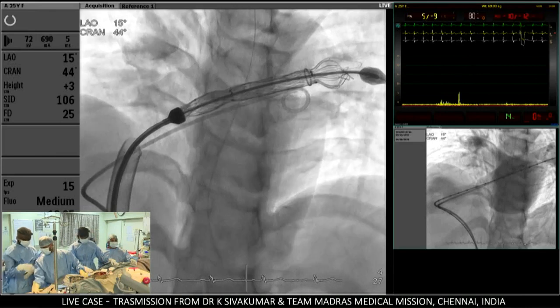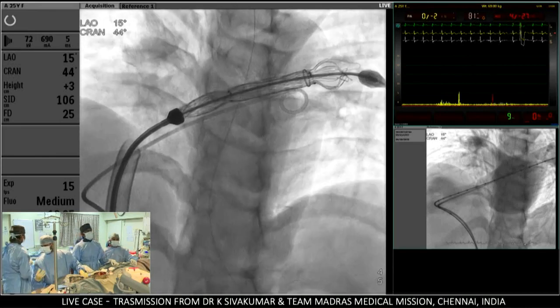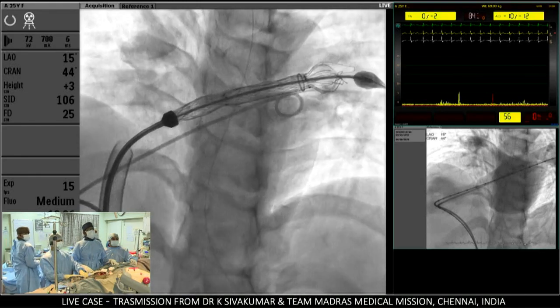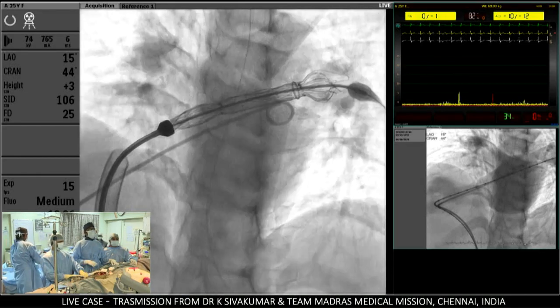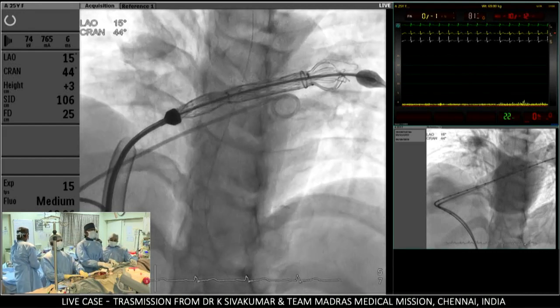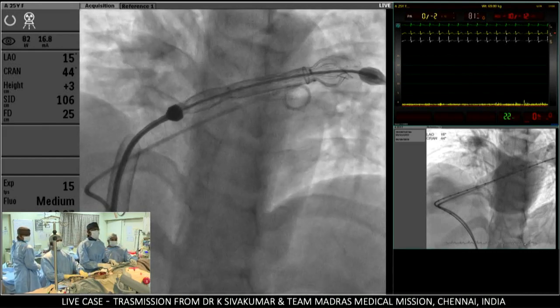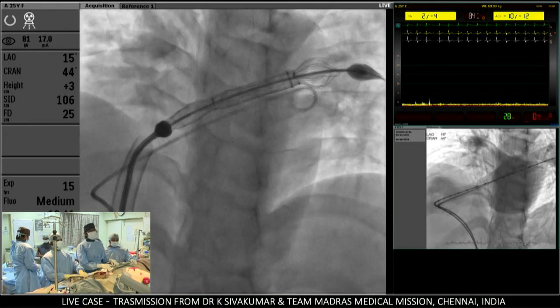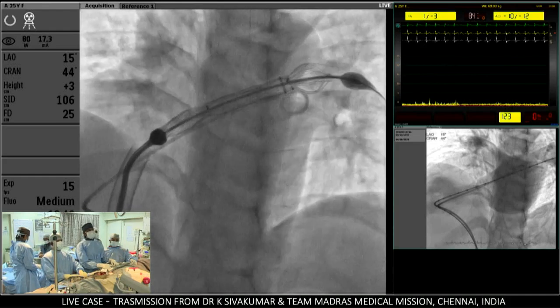The balloon stretched diameter was 32 to 33, and so we are quite deep inside, no, Pramod? It's quite deep. So I'm loosening out a little bit. Yeah, you keep, yeah. Keep releasing.